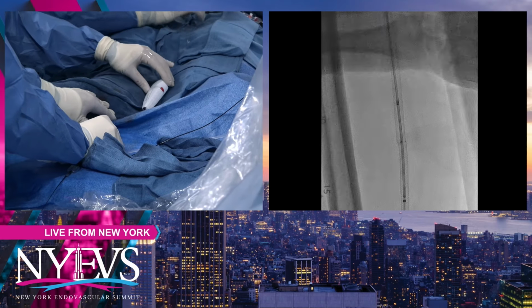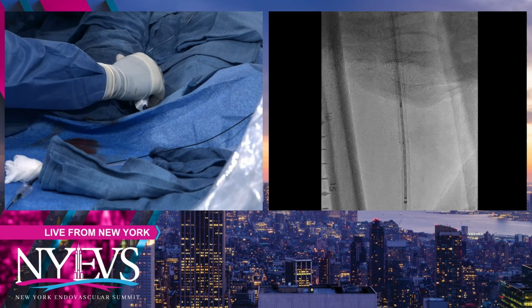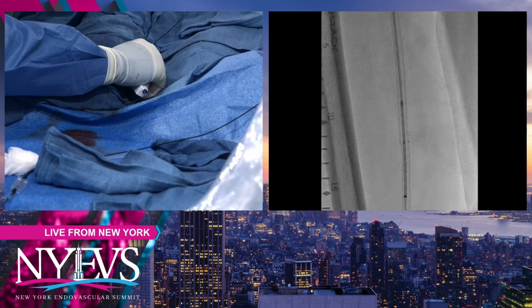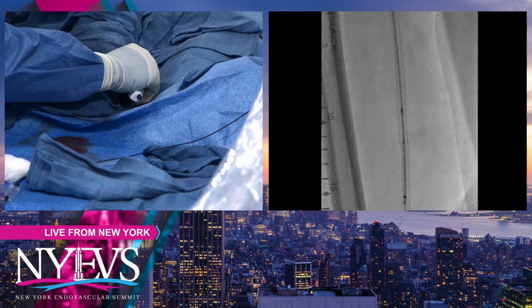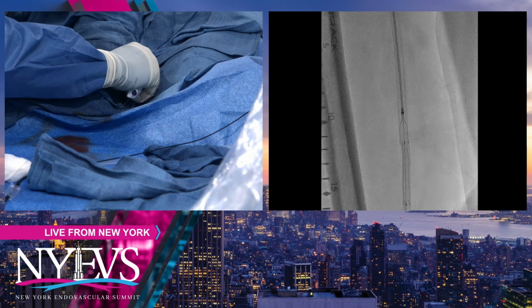A little more. The amount of drug involved is pretty low, relatively speaking. We talk about paclitaxel doses. I think patients get repeat interventions over and over again. I think there is a small risk of getting to chemotherapeutic doses, I suppose, but in this case, I think the amount of drug is still relatively small.